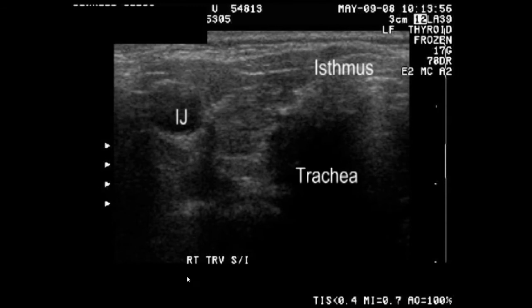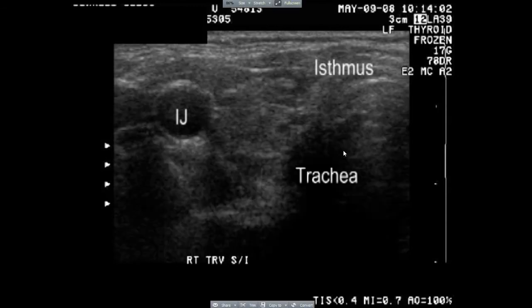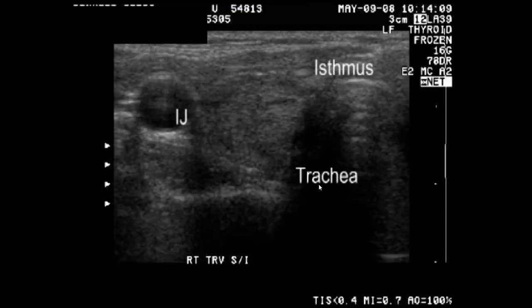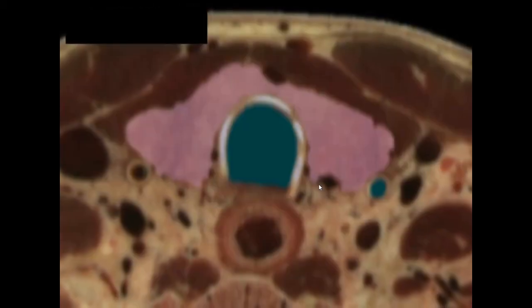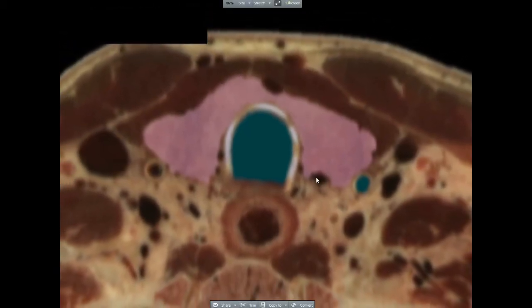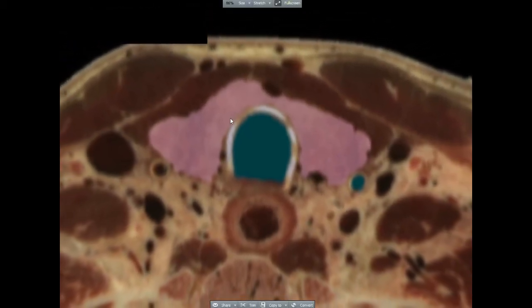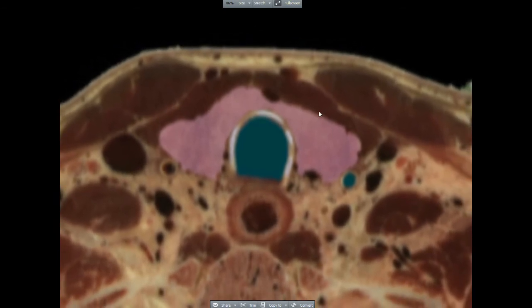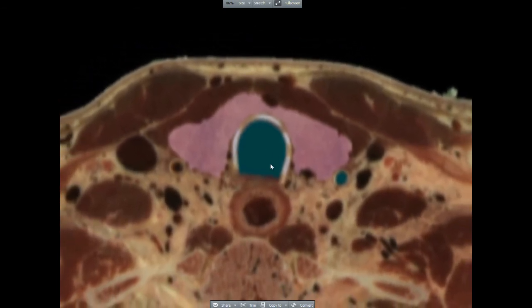Once again, we orient ourselves by finding the trachea and a vessel, in this case the internal jugular vein. We can also clearly see the isthmus of the gland. These images from VH Dissector show the intact thyroid gland and its relationship to the musculature, the trachea, and the esophagus.